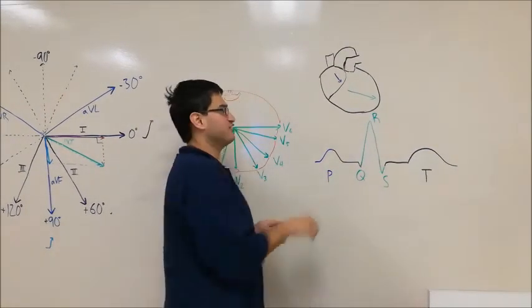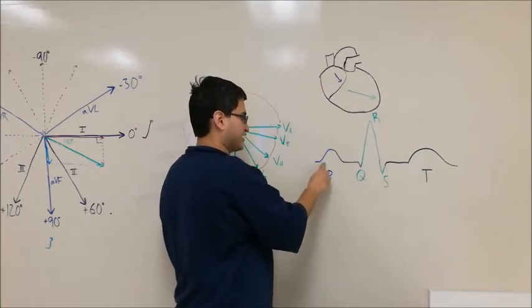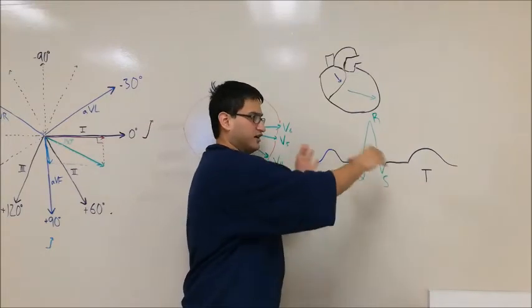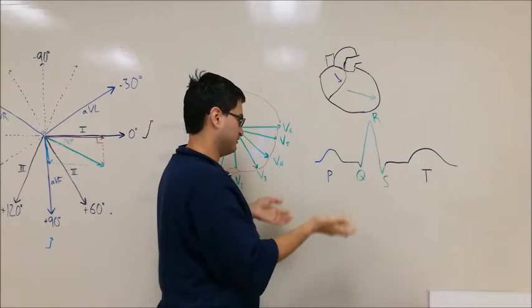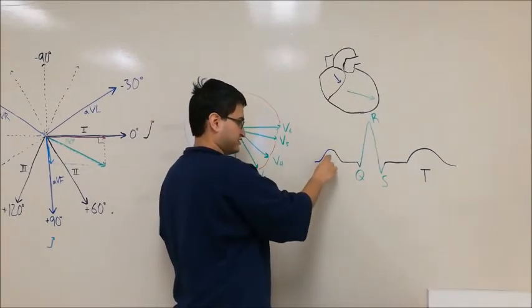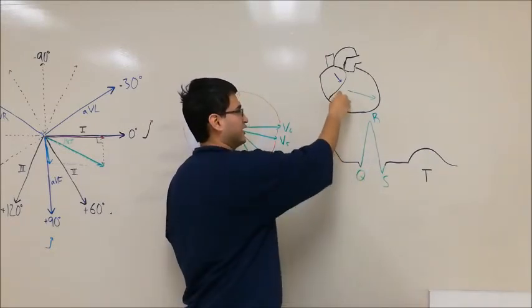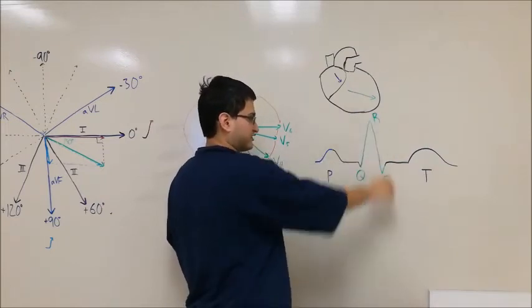Now note the direction of atrial depolarization as a vector. This corresponds to this positive deflection of this P wave. And just to be clear, this PQRST waveform is from a lead 2 in this image here. Now, as I mentioned earlier, because of this atrial direction, the P wave is going to have a positive deflection. Now, the overall ventricular depolarization is going in this net direction. So this is represented by an overall positive QRS complex.